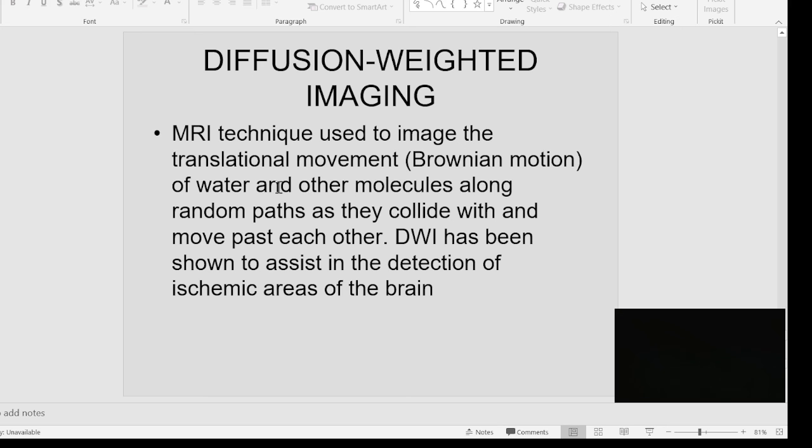So, mas nindot kung nai-ischemia, usually in mga ischemic stroke such as your embolism, lacunar, thrombotic. So, mas nindot gamiton ang diffuse weighted imaging o DWI. No? Makita nimo ang extent of injury.